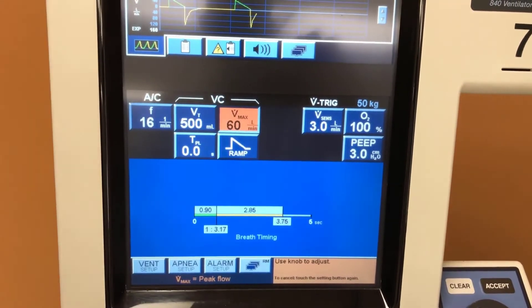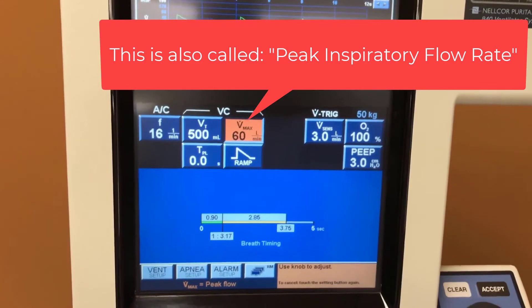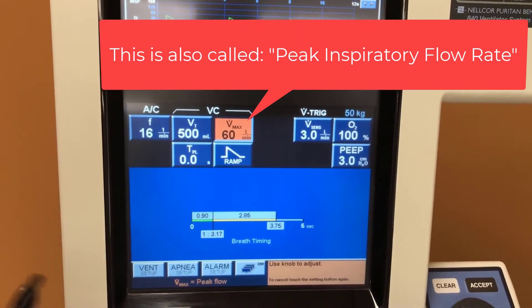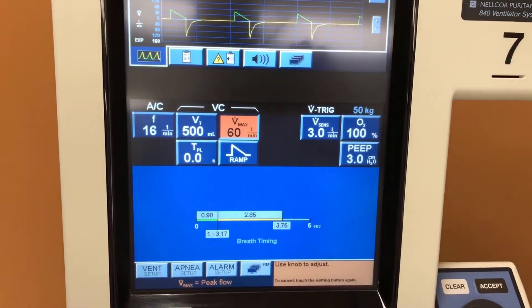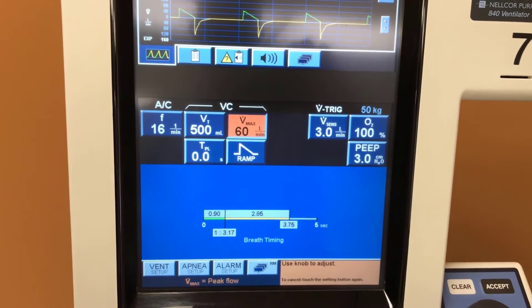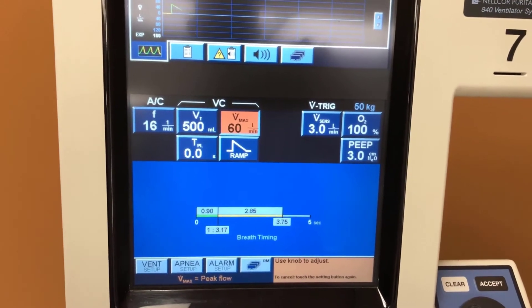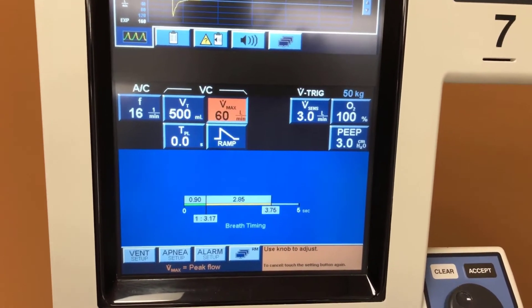This number over here is V-dot max. This is the maximum inspiratory flow rate, and we've set it at 60 liters per minute, which is standard.